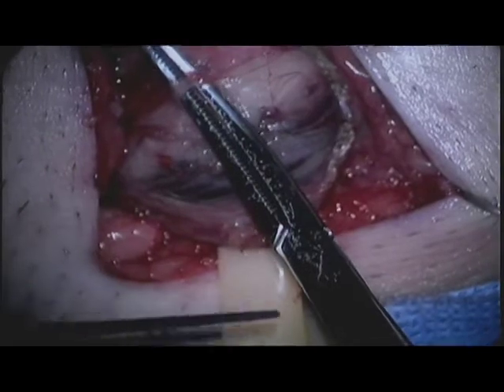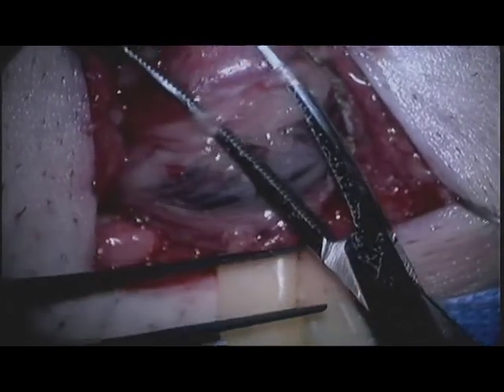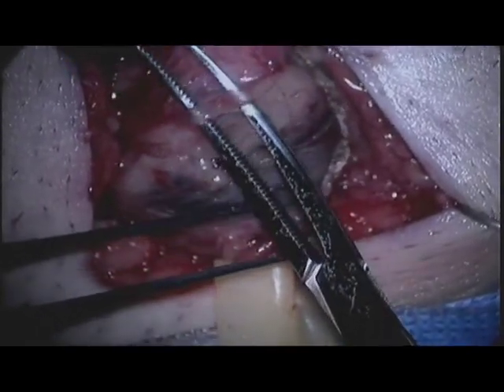Here, a lymphatic structure has been identified. This will be kept out of the way using a vessel loop.